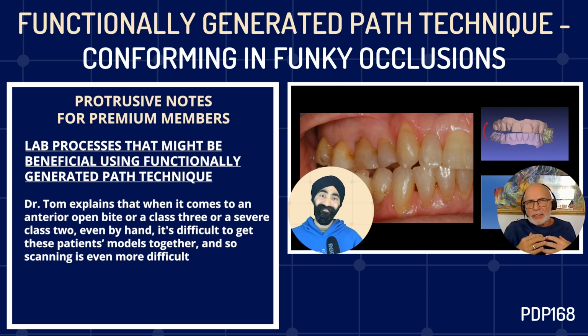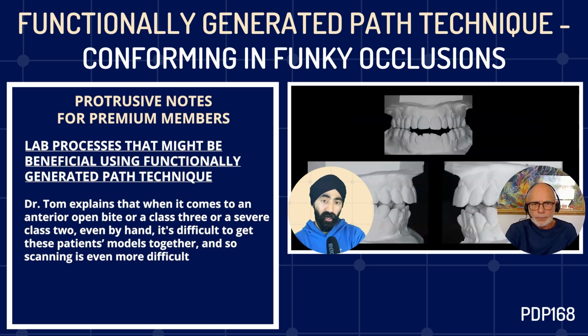But when you scan, if your technician adjusts the way that the models meet on his screen, of course, that's the static. What it doesn't give you is the dynamic excursions that these patients make off their back teeth, not their front teeth, because they don't touch. It gives a good guess, and these algorithms and software have a part which generates it, and it relies on the wear facets existing on the teeth. But yeah, it's a guess. It's still an algorithm, and it's just like semi-adjustable articulators in these funky occlusions. It's not going to be representative of the mouth or the TMJ.